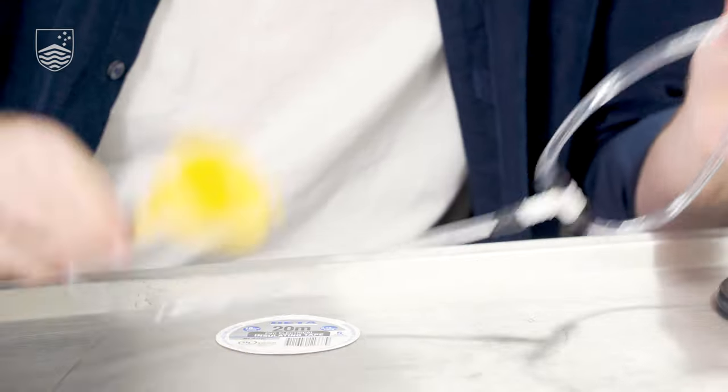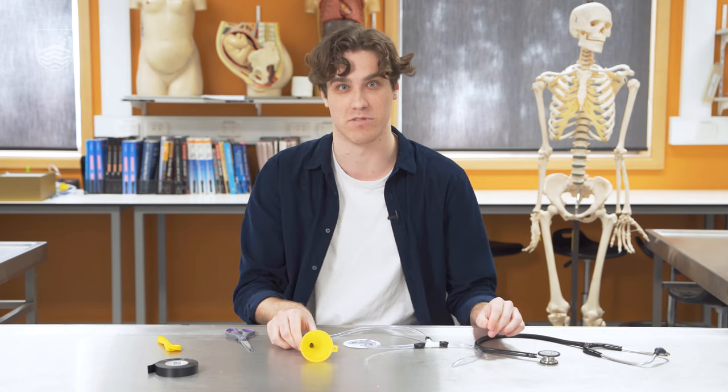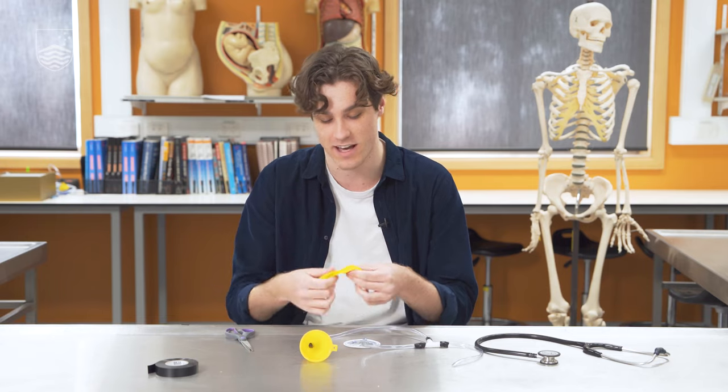Our stethoscope is starting to take shape, but now we're going to make the diaphragm which sits on the end of the funnel, which will amplify the sound a bit better. To do this we're going to use our balloon — we're just going to cut the end of the balloon and then stretch it across the funnel.